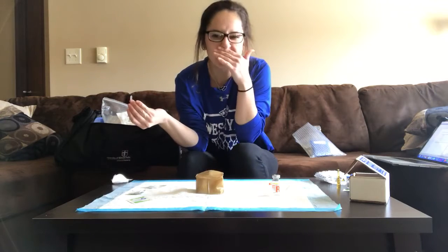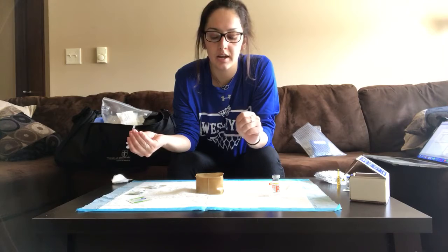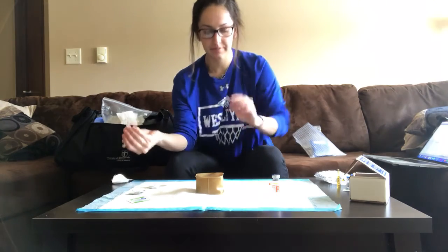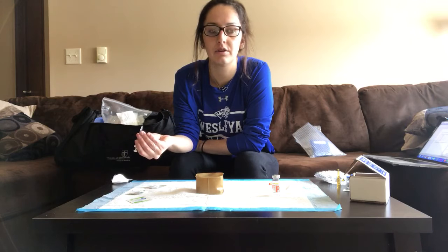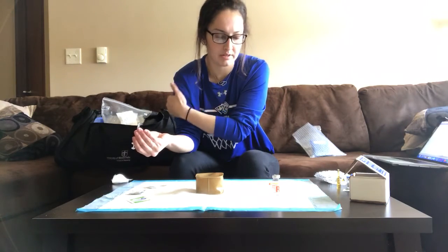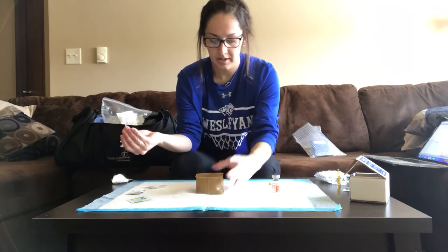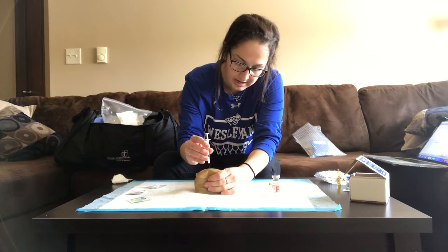Oh, the sites you can inject the patient are in the abdomen, around 2 inches below the umbilicus, the trochanter, gluteus, the deltoid, okay. So I'm going to pinch 2 inches of the skin. I'm going to inject the needle at a 90-degree angle.